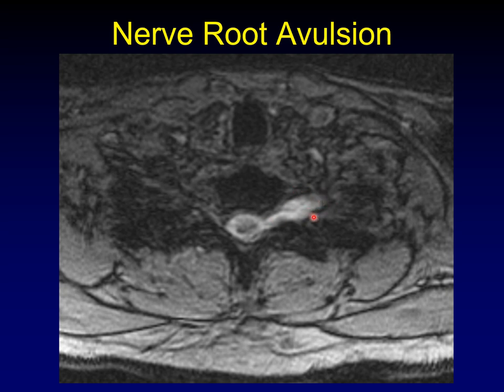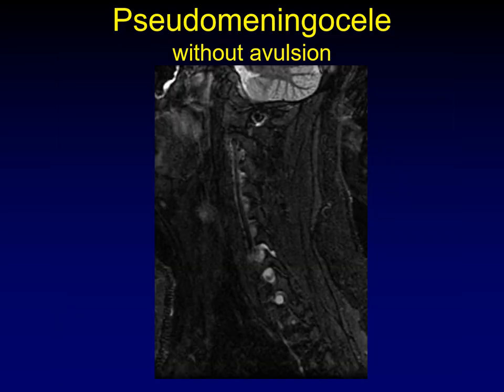It's possible to get a pseudomeningocele without avulsion — here you can see a central nerve still present in the middle of the enlarged CSF space running through the neuroforamen, displaced but intact. These findings are often multilevel: pseudomeningoceles and nerve root avulsions can occur at multiple levels simultaneously.